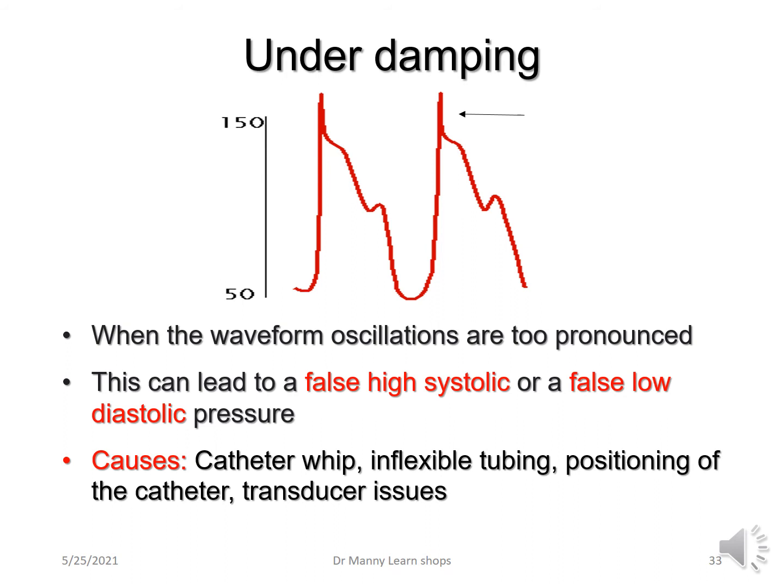Or it could be the transducer. Especially with transducers these days, they're disposable. And disposable isn't always the best. It may not work effectively because it wasn't made correctly, or it wasn't made to last.